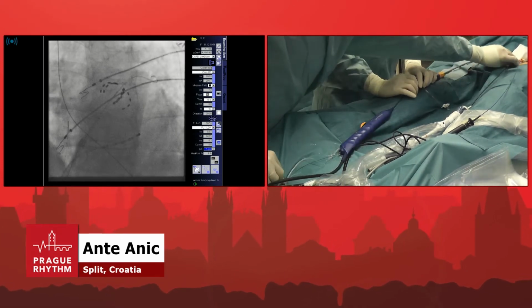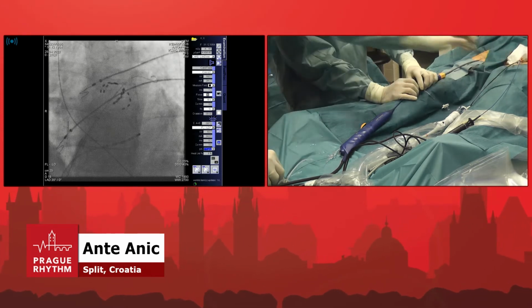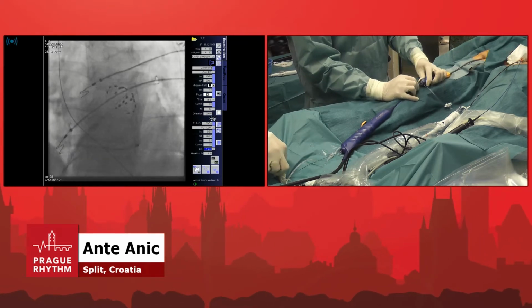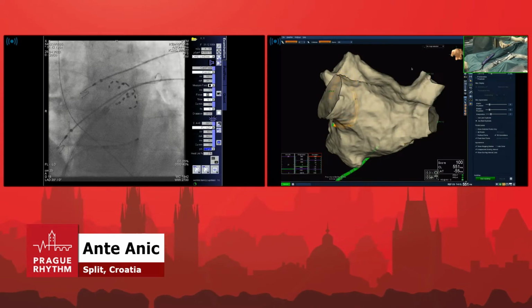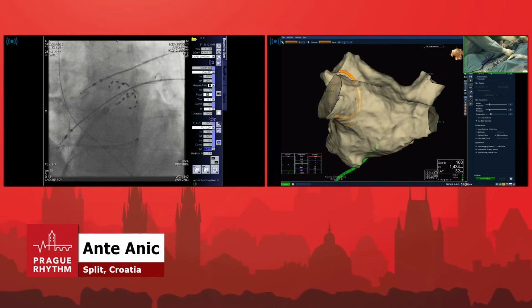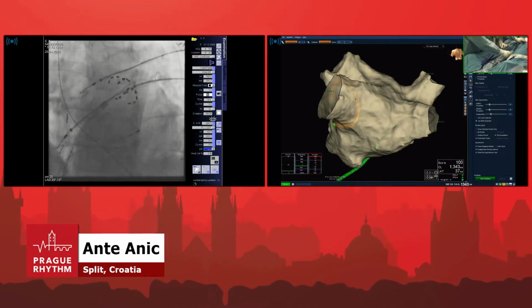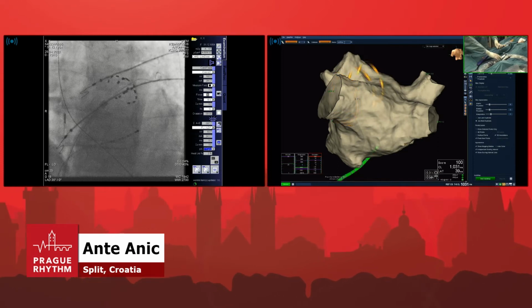We're going to do our best attempt to do this ablation integrated with the NavX. It's not a seamless integration. You will see that we're going to have to shut the guide off for each application. And okay, I like this. So Predrag, do you think I have a contact? I think we are in contact. Of course, it's covering already the whole aspect. So actually, we are ready, not too many electrograms, but we're going to treat this trunk as separate veins.